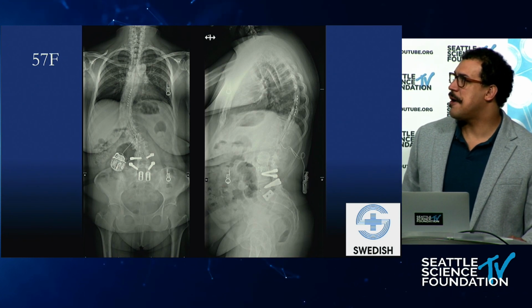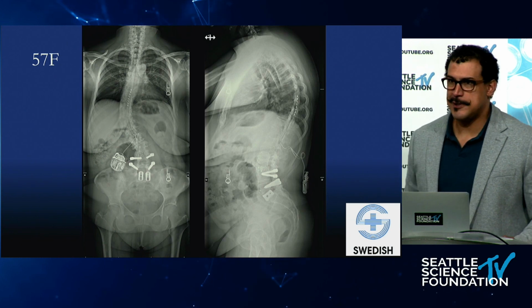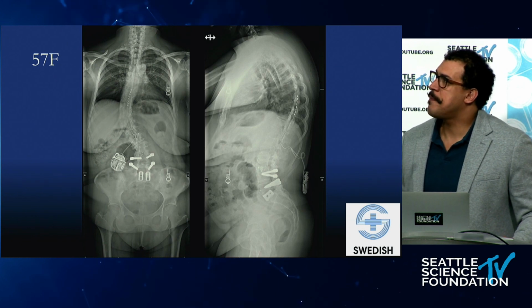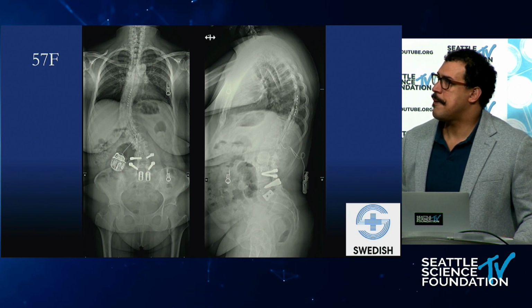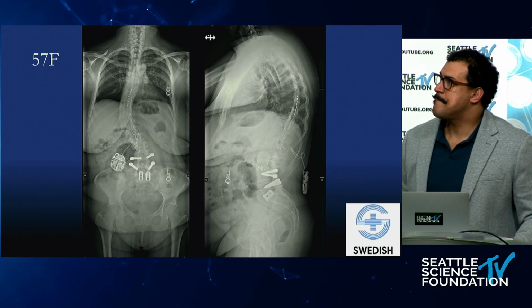I think the era with 3D printed porous titanium implants has meaningfully changed the game for standalone laterals. We were the folks publishing those reports back in 2009, 2010, and 11, saying standalone lateral in the setting of deformity, you have to be very careful because of the high failure rates.